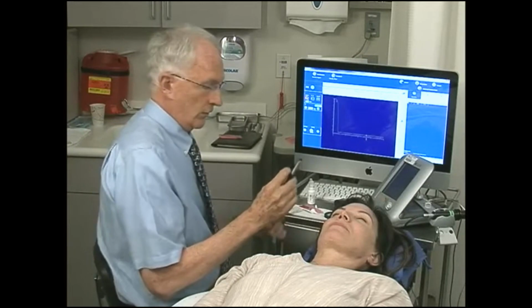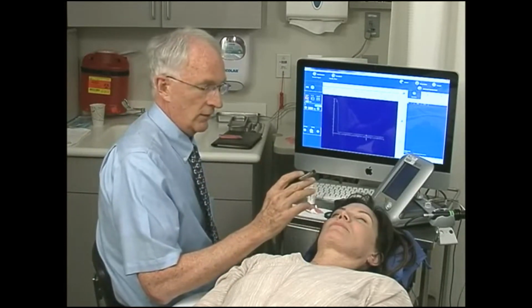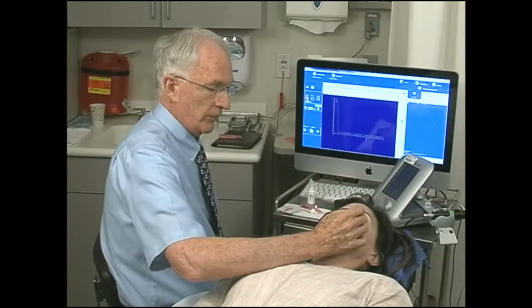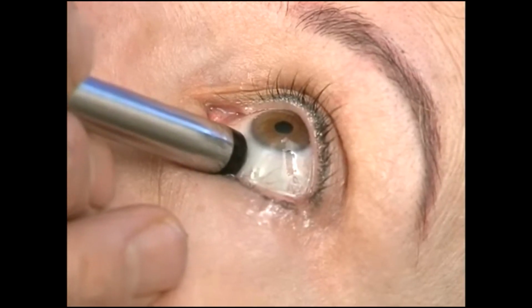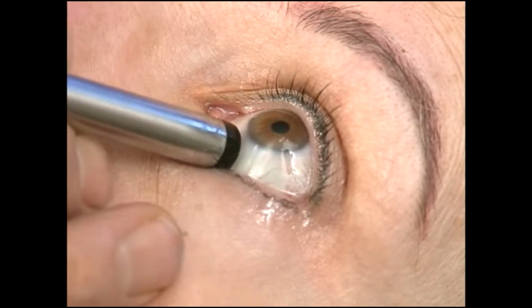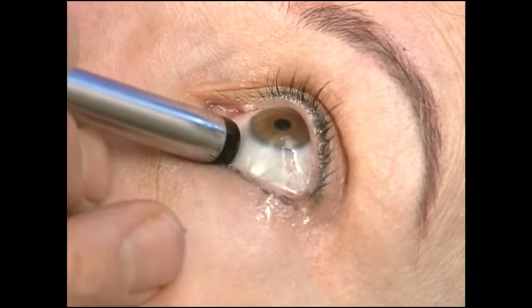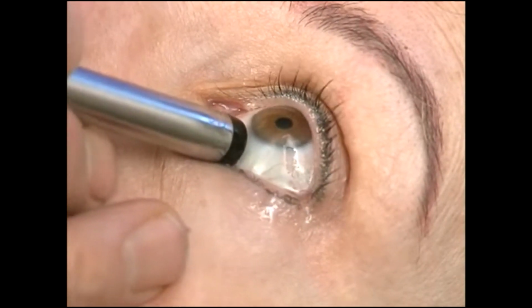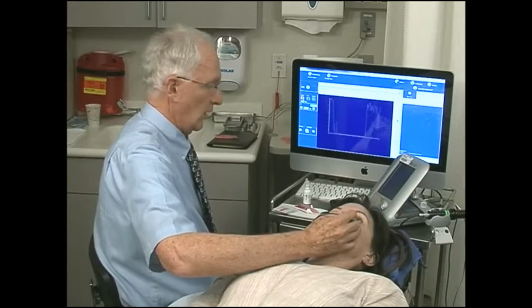The patient has had a drop of anesthetic placed in the eye, and I have the eye open. I will demonstrate on the left eye, placing the probe at the 6 o'clock limbus, and then I aim superiorly, going across the eye to display the superior part of the globe. So even though the probe is at 6 o'clock, I'm displaying the 12 o'clock position in the globe. And as I move the probe, I angle it down towards the inferior fornix, and I watch the display on the screen.